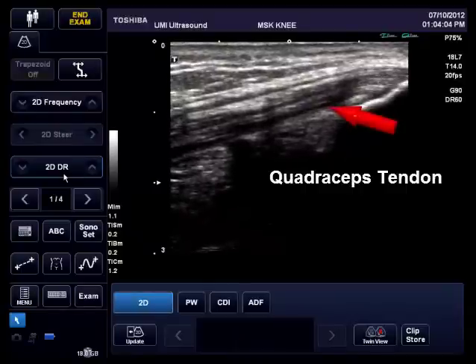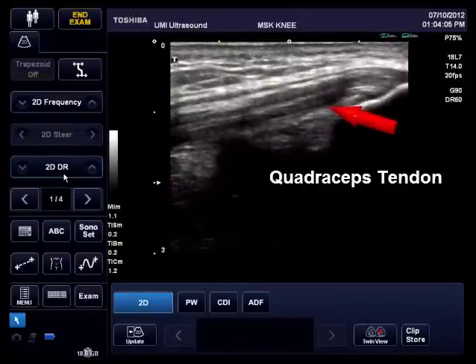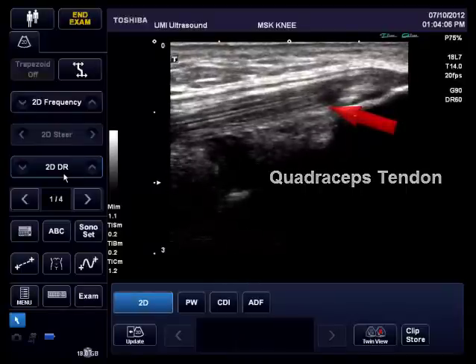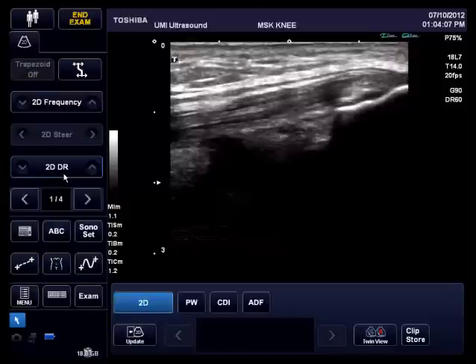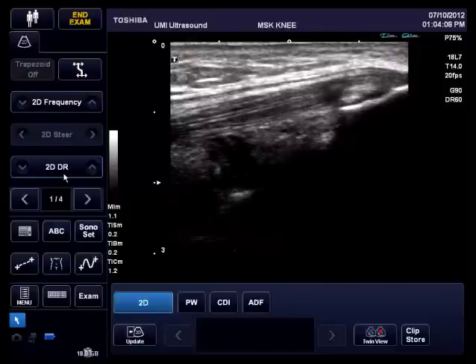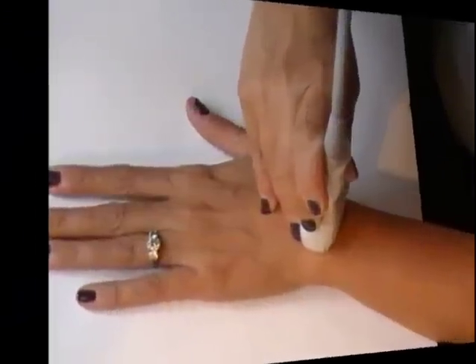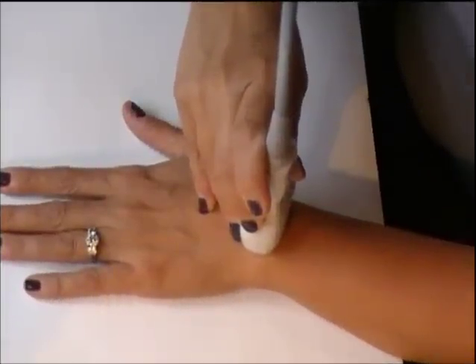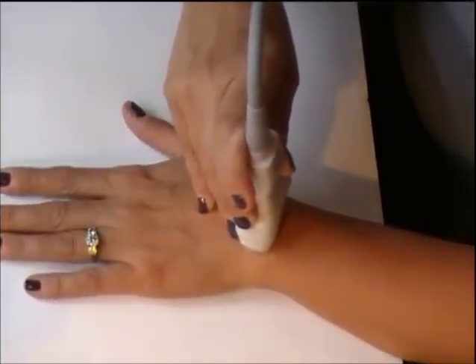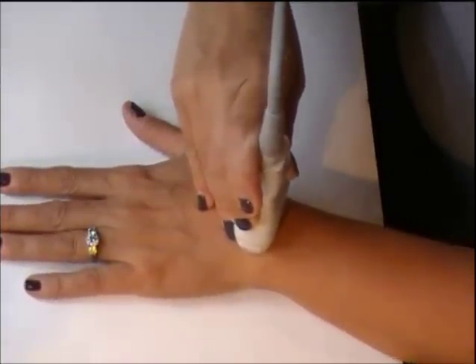The artifact appears as a hypoechoic area. Rocking the transducer side to side or heel-toeing the transducer will help resolve any question of a possible tear or edematous area.